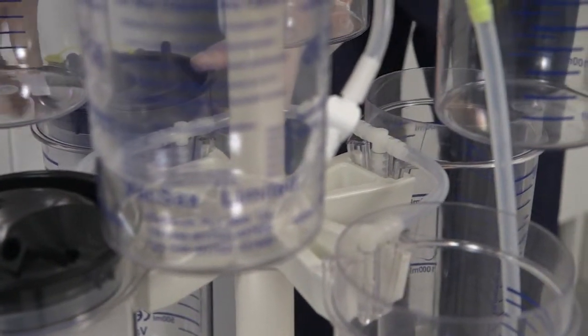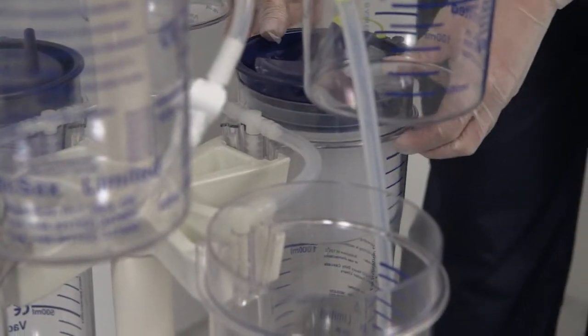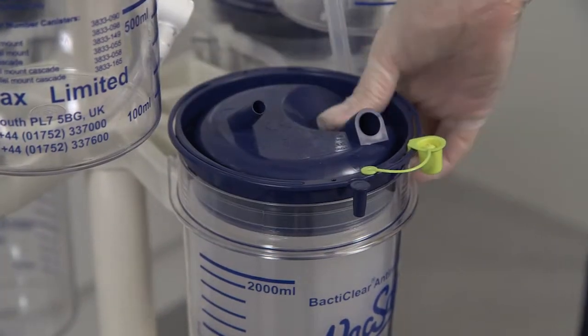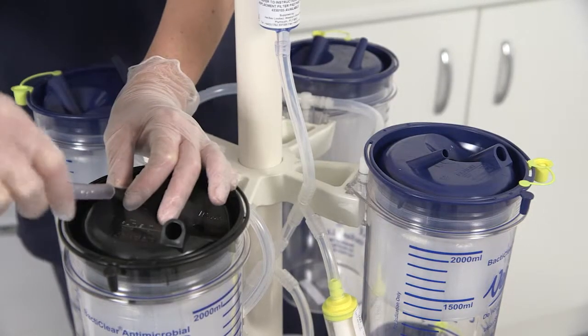Then place the remaining 3 blue top cascade liners into the bottom row, pushing them down into the canisters firmly. Starting at the top mounted black lid liner and working round to the last blue liner, connect the cascade tubing as shown.